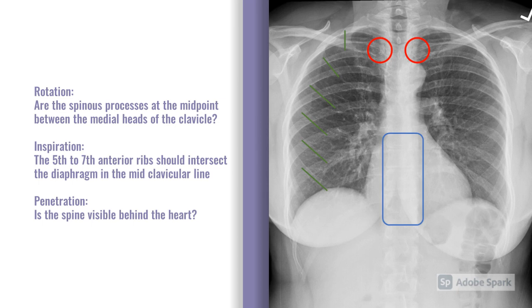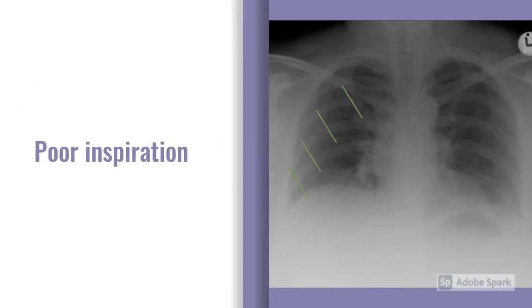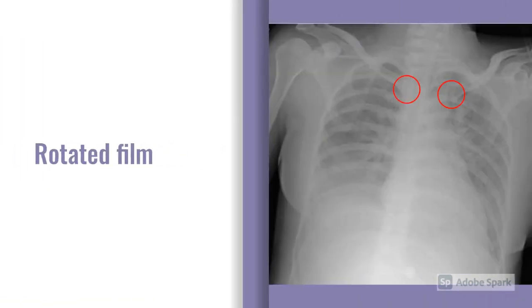With static pictures in exams, it's important to comment on the penetration. The first example shows a poorly inspired film — there aren't enough anterior ribs visible, and certainly not the 5th, 6th, or 7th dissecting the diaphragm in the mid-clavicular line. The second example shows a poorly rotated film: the red circles highlight the clavicle heads, and in the middle of the two clavicle heads there isn't a spinous process, which distorts the heart position and can make interpretation difficult.